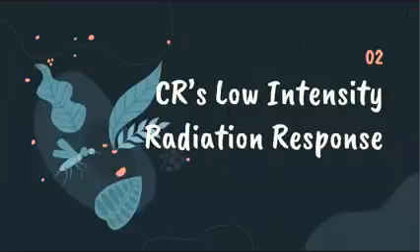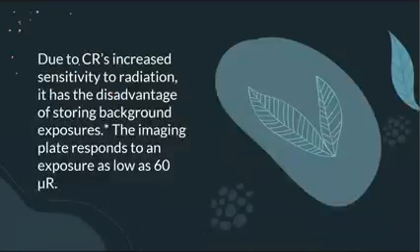So we go with the next one, which is the CR's low intensity radiation response. Due to the CR's increased sensitivity to radiation, madali siyang makadetect ng radiation, no? So it has this disadvantage of storing background exposures. The imaging plate responds to an exposure of as low as 60 microroentgen. Okay? It has been known that background exposures are weak in nature. Since they have low energy, they can be easily sensed by the PSP plate due to the plate's low intensity response.